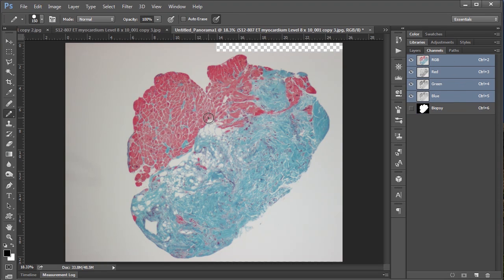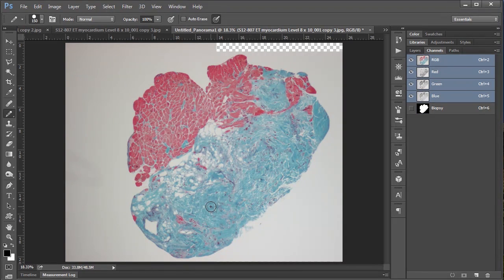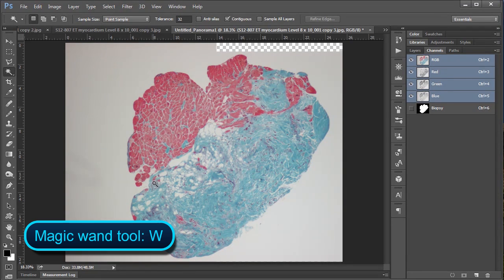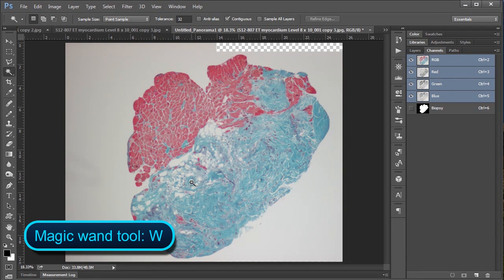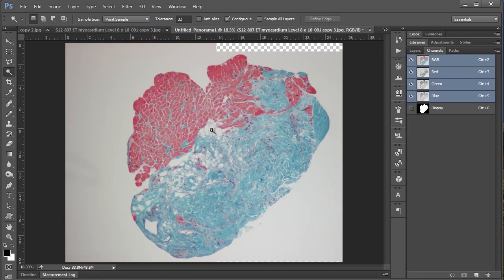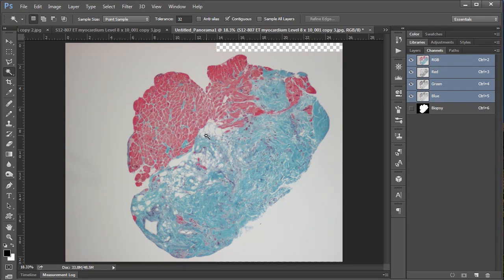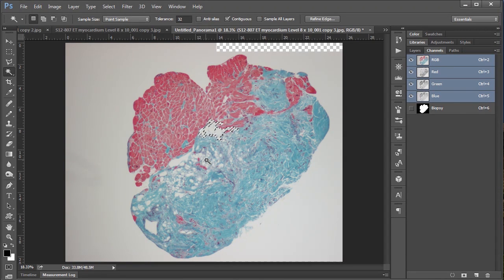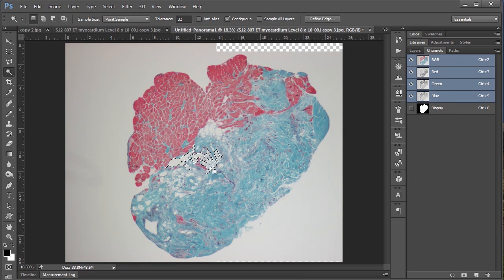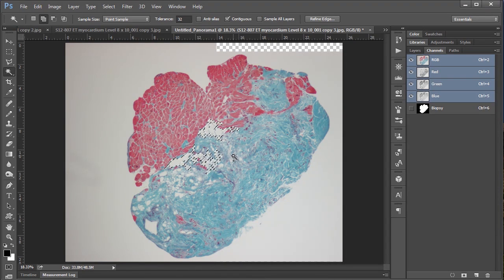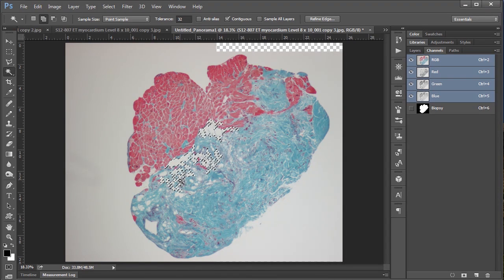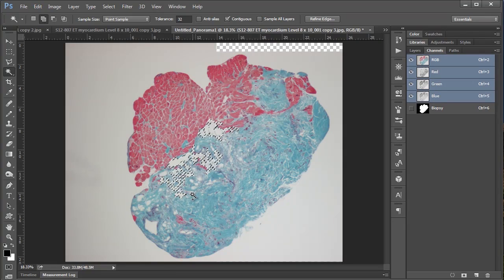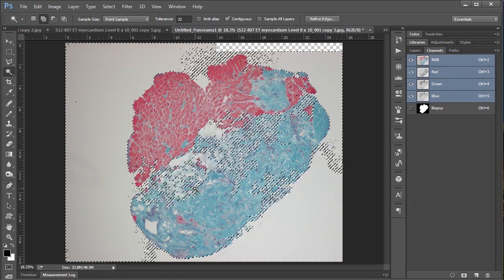So the next thing we want to do in this case is select the fat cells. And again I found the best selection tool for this is just the magic wand tool, which again you can get to by pushing W. And so all you need to do is go through. We're going to use the same settings as before just to note. But you just want to go through and select the fat cells that you're interested in. And I made a mistake here. You want to be holding the shift key so that all your selections are added together.